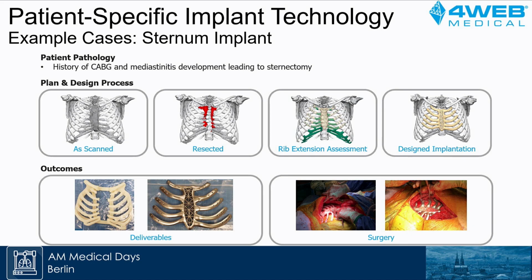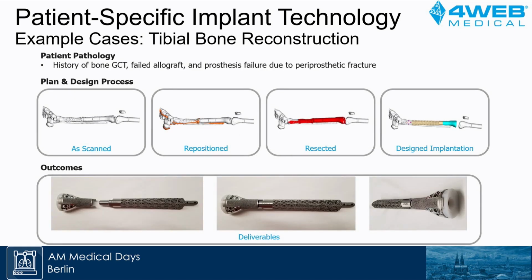That's where the 3D printed implant comes into play, because you can design a structure which has a lattice to the front, and it has some holes in the solids for interaction with the bone, and the bone fills that space pretty quickly and gives you a very good construct. And so let's do the last 2 examples.